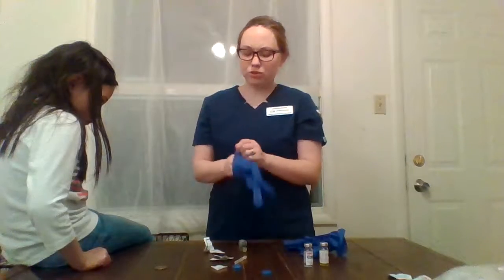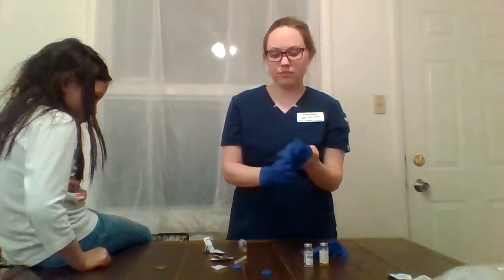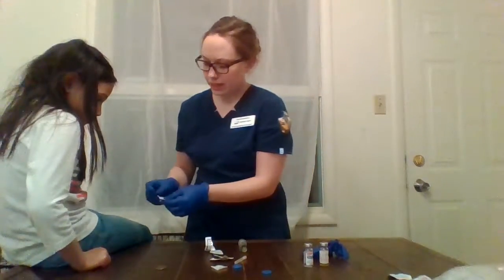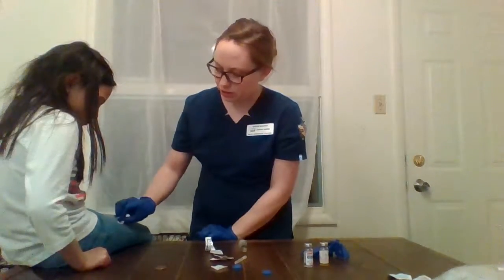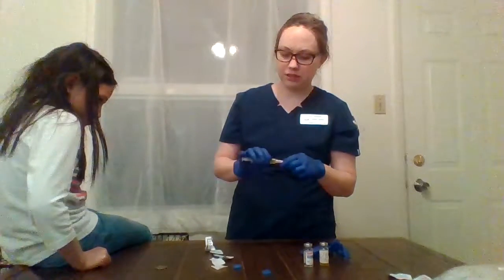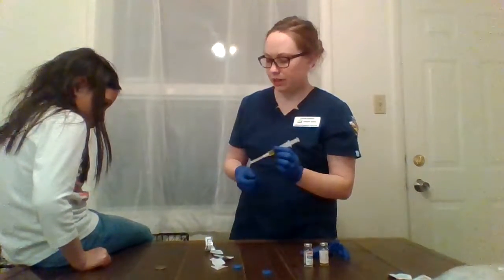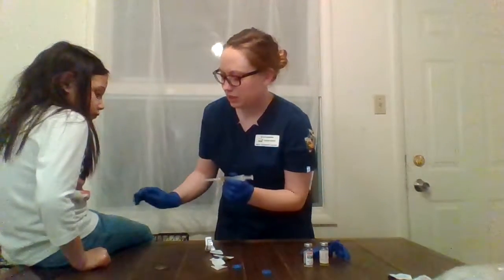I'm going to put on clean gloves. I'm going to clean the injection site in a circular motion with an alcohol pad, starting from the center and going outward. I'm going to put on a sterile needle. If this were a real injection, I'd be uncapping the needle.